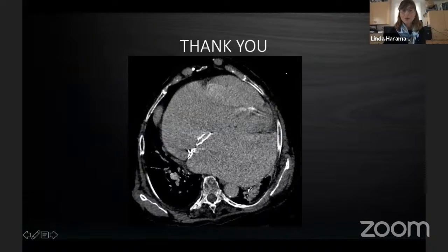And this is one of the most giant ASDs ever with device closure. And basically, this is the right atrium and this is the left atrium. So the biggest ASD ever.